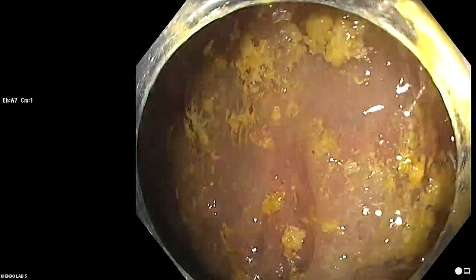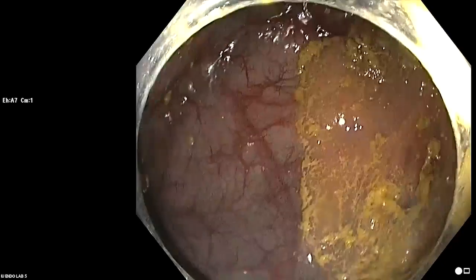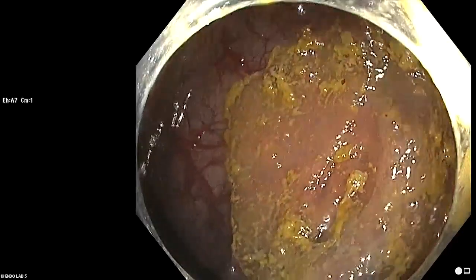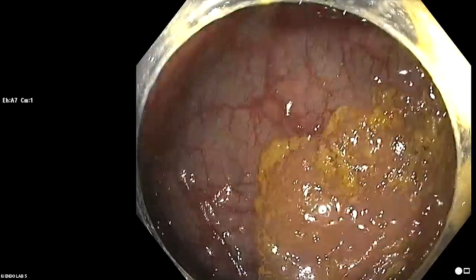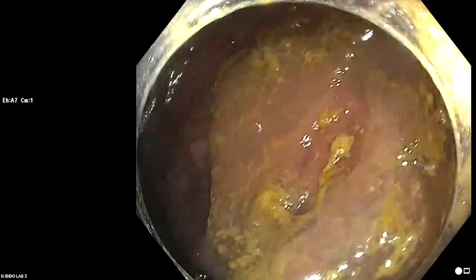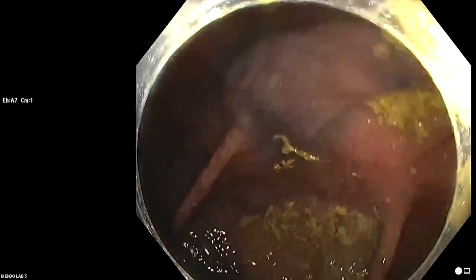In this case, because this lesion is so flat, there's a good chance that it will have tacked the lesion down. The places where I see fibrosis that results in tacking down are either a very flat lesion, anywhere in it, or sometimes people will biopsy the edge. I think it's a mistake to biopsy the edge because it will tack that down. If you're going to biopsy any lesion that you're going to refer, it ought to be from a bulky part of the lesion.